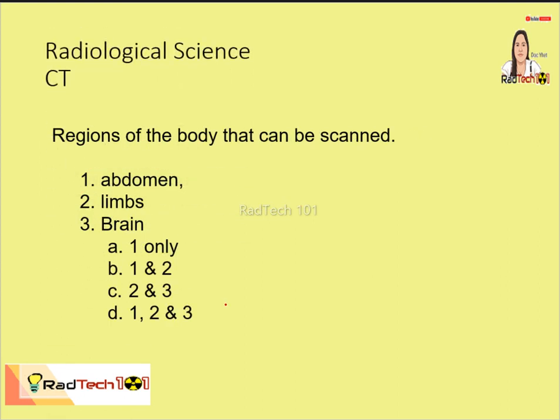Regions of the abdomen that can be scanned. So, of course, regions of the body pala. So, abdomen, yes, extremities, brain. So, all can be scanned.